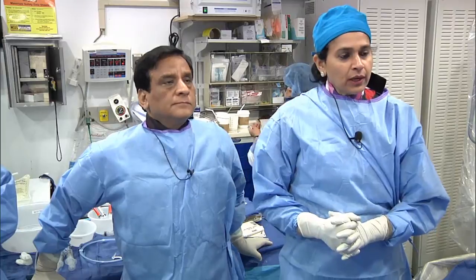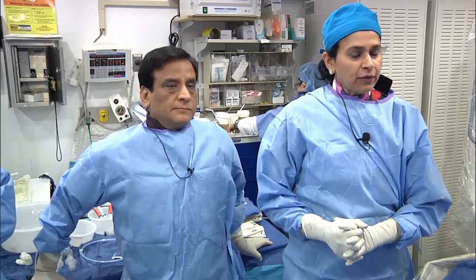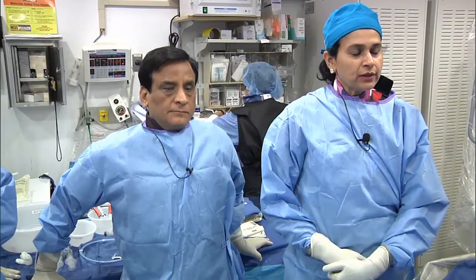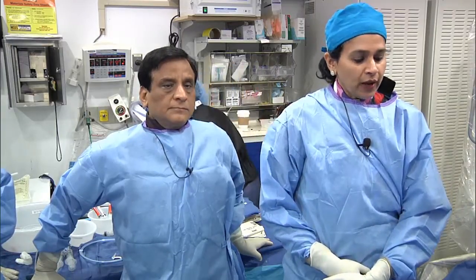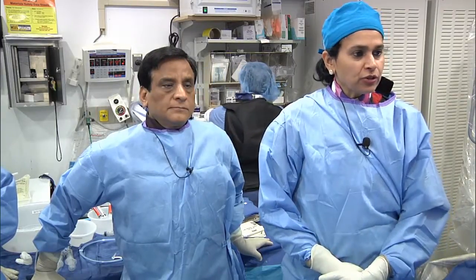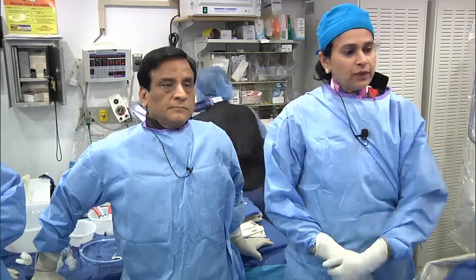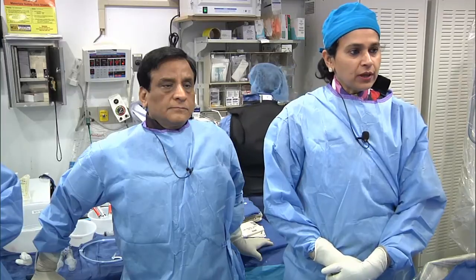And now getting any wire, even if we try all different wires, we just keep going through that subintimal channel where the Fine Cross tracked. Further after that, we created some more dissection in the apex.